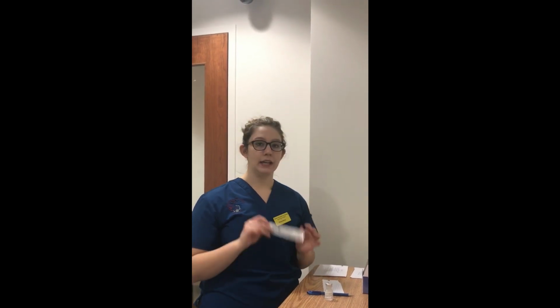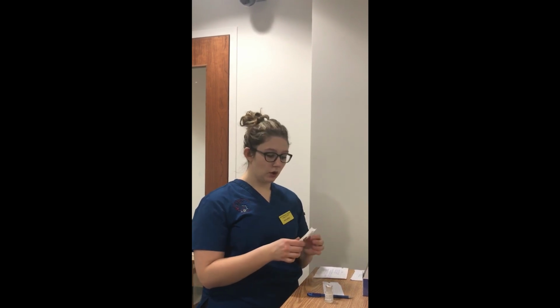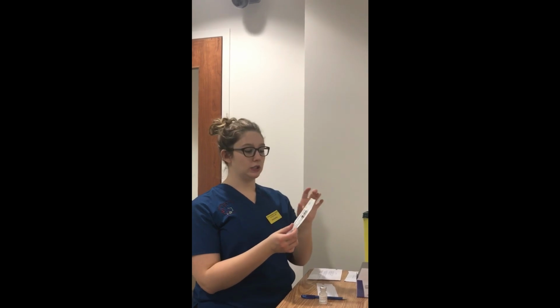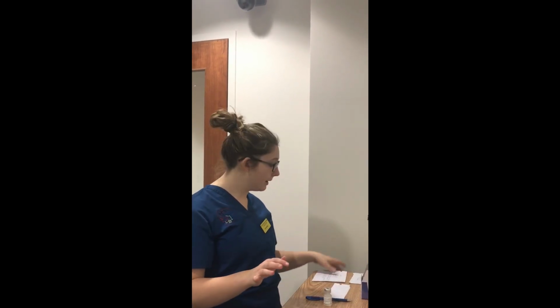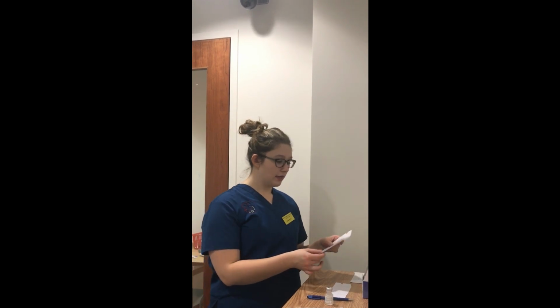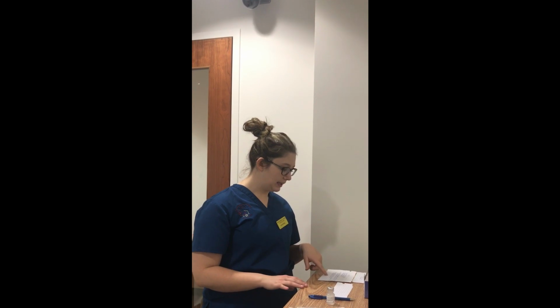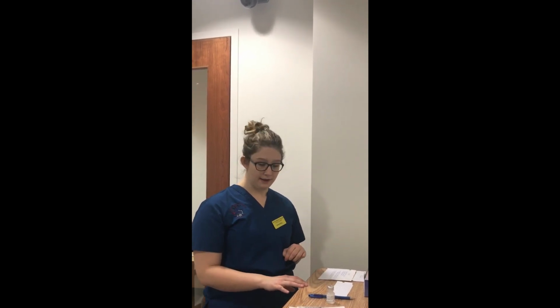Once again, I am using a 20 gauge needle, and it is a 1 ml syringe. So this one is already put together, but if it wasn't, you would just screw the needle part onto the syringe. I've checked my MAR. The medication that I will be administering is Haldol. It is 4 milligrams per 2 ml, and I will be giving 0.5 ml.